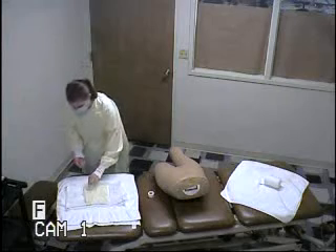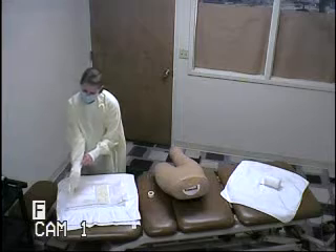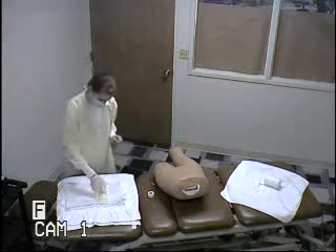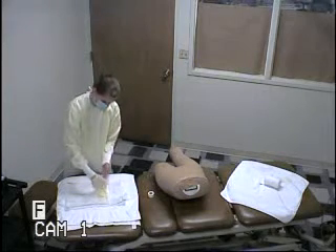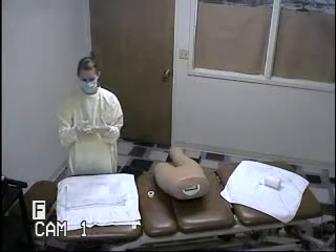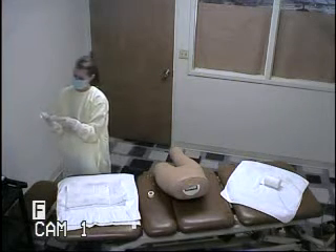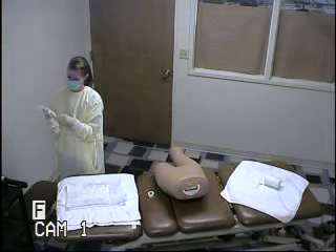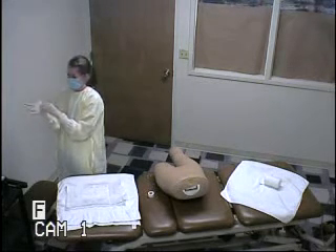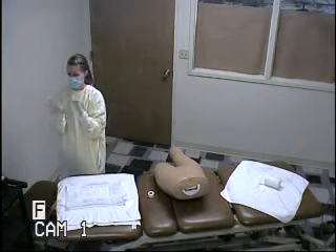Pull this up a little more. And then I'll put on my gloves. Touching just the inside of this glove. I'm going to be a little weird-fingered for now. And I'm going to fit this one into this. And I can fix it now that I have my gloves on. There we go. Alright.